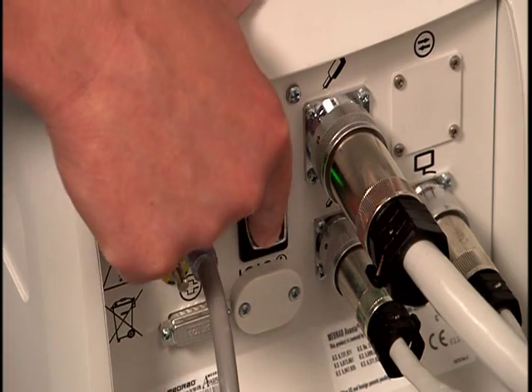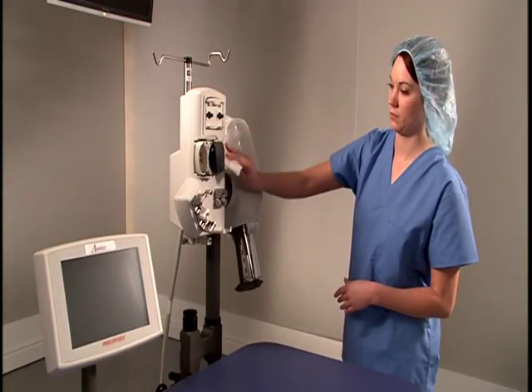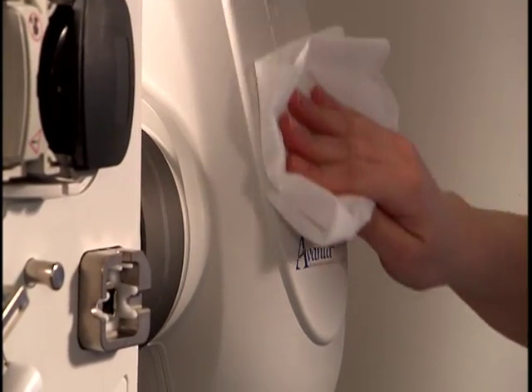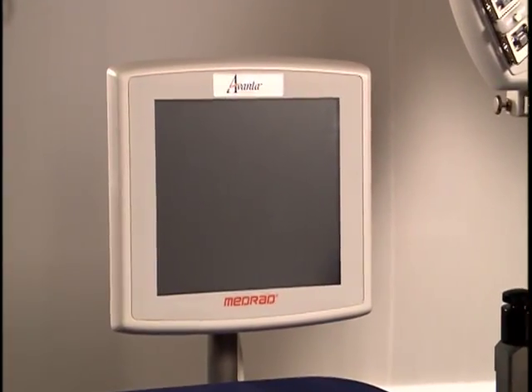To clean the Avanta Fluid Management Injection System, disconnect it from the power source. Clean the system components using only a soft, non-abrasive cloth dampened with mild cleansing agents or water. Never use abrasives or harsh chemicals. Avoid spraying cleansers directly on the components, particularly the touchscreen.